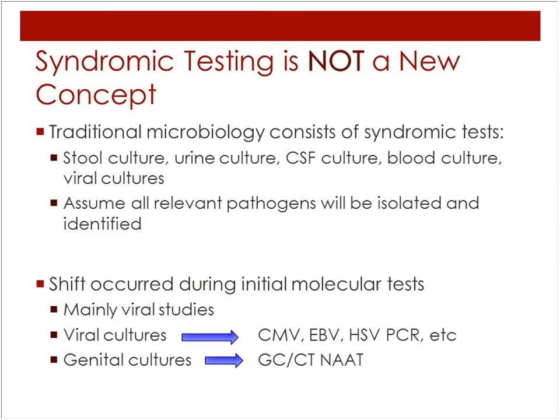The angle behind these sample-to-answer type of technologies is really syndromic testing approaches, which is by no means a new concept. Traditional microbiology testing really does consist of syndromic testing. So, for example, a stool culture is performed on a patient that presents with diarrhea or other gastroenteritis symptoms, and CSF cultures are ordered on a patient presenting with infections of the central nervous system. The provider will assume that all relevant pathogens will be isolated and identified if present.